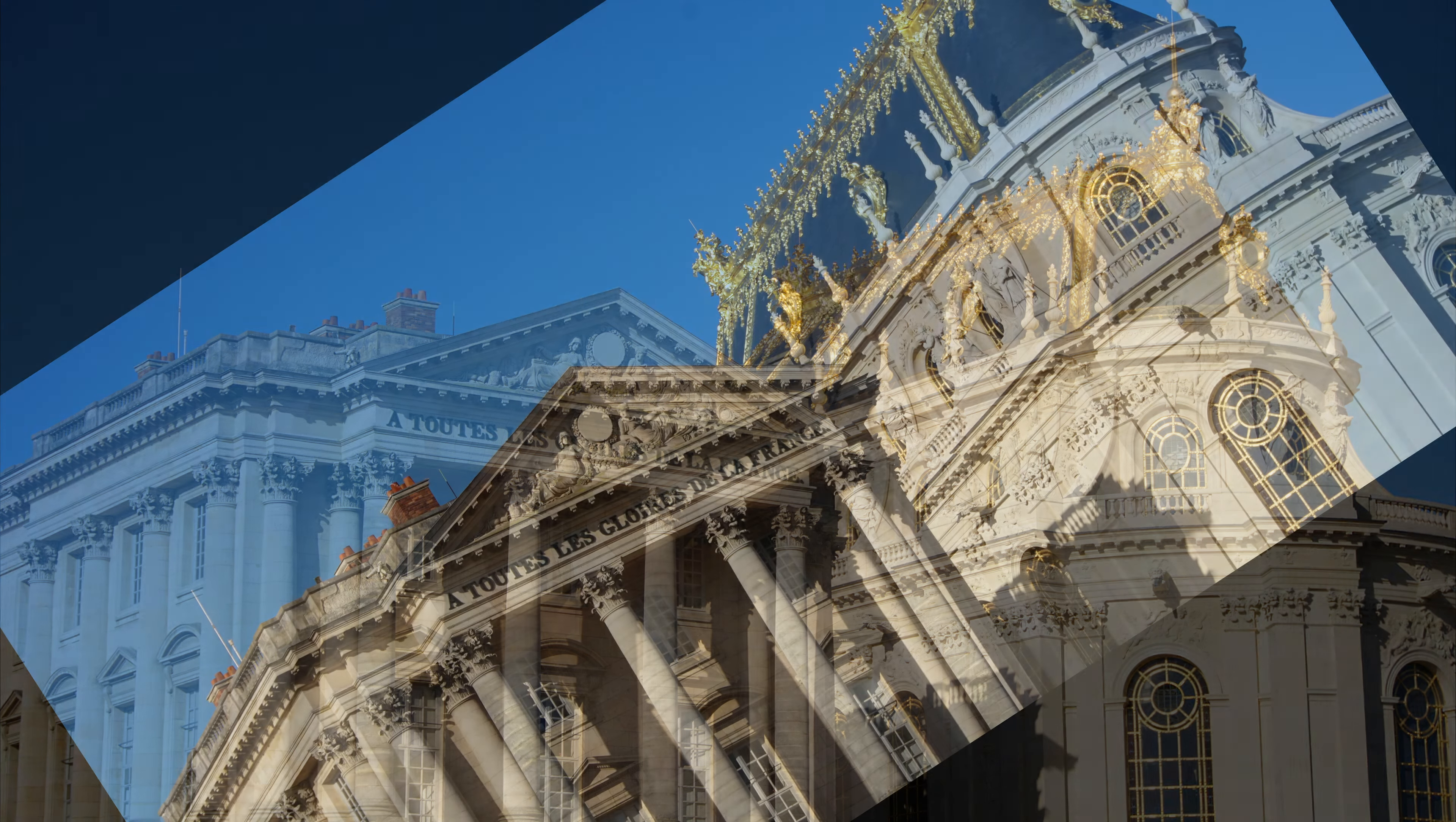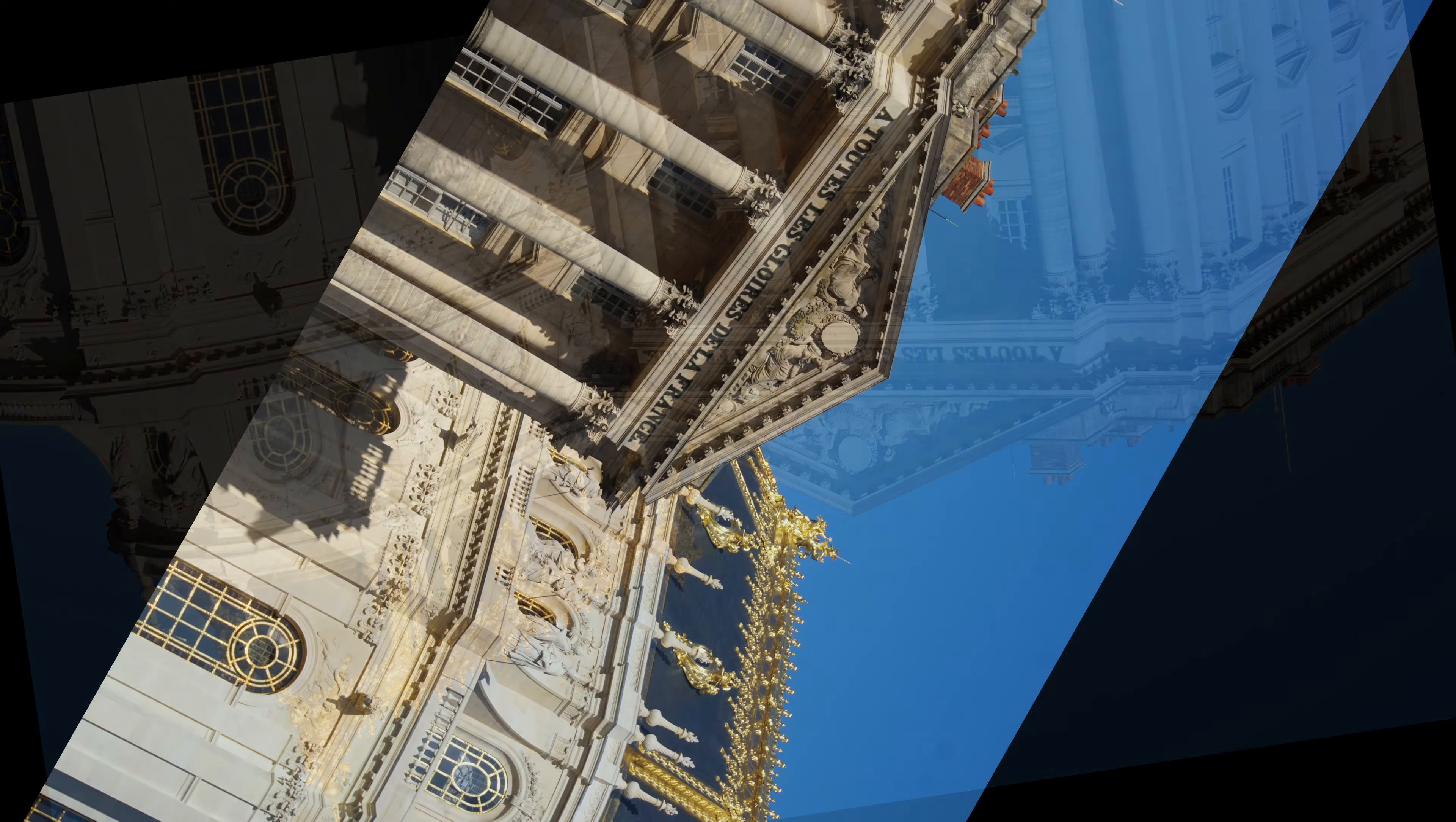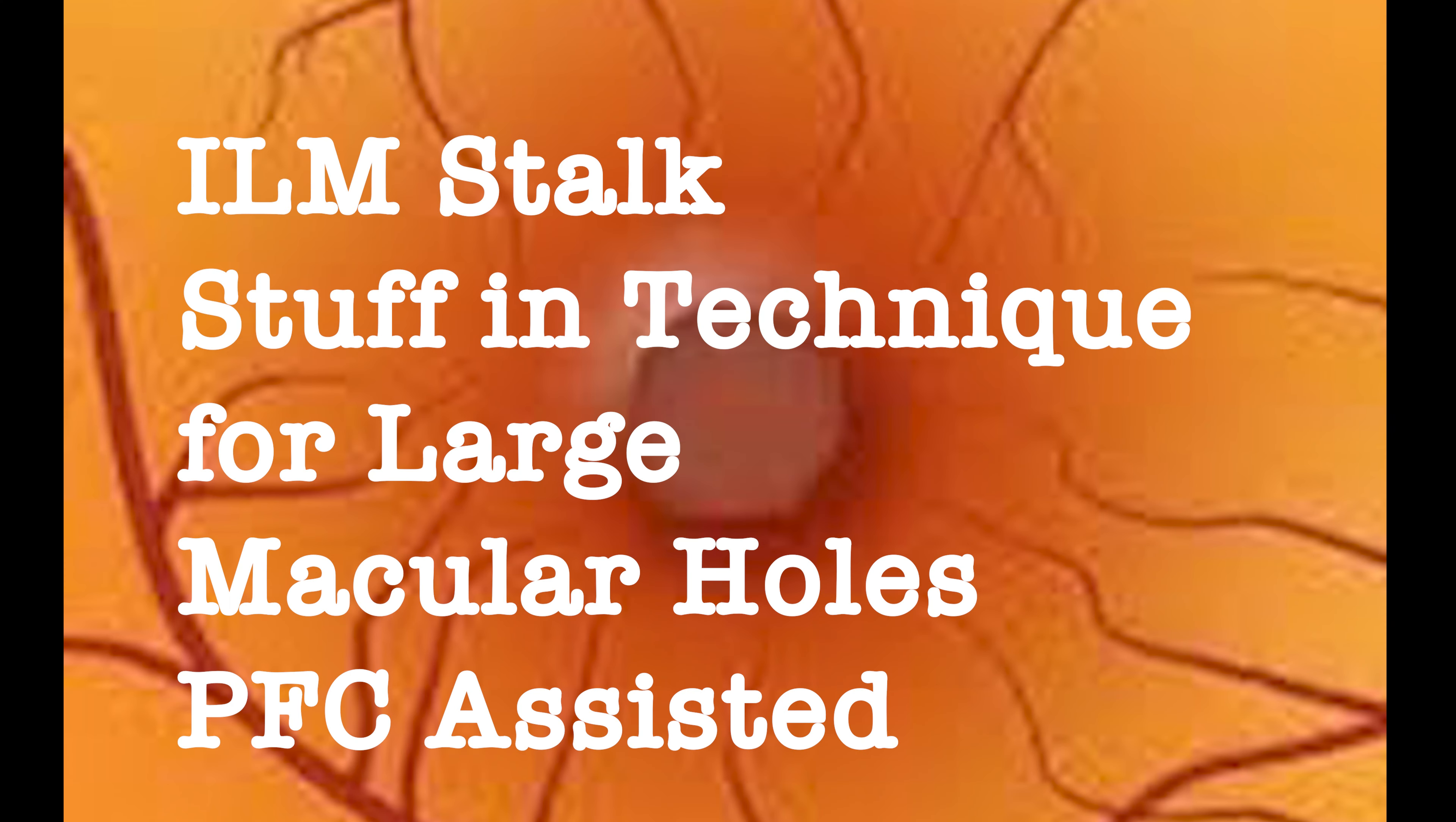This is inverted vitrectomy. ILM stalk stuffing technique for large macular holes, PFC assisted.